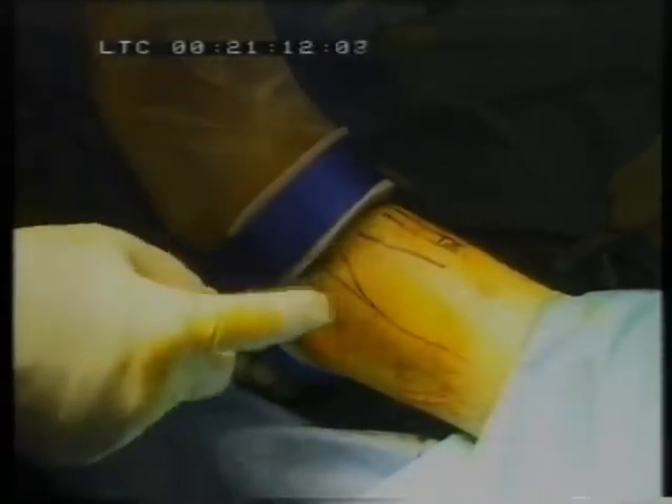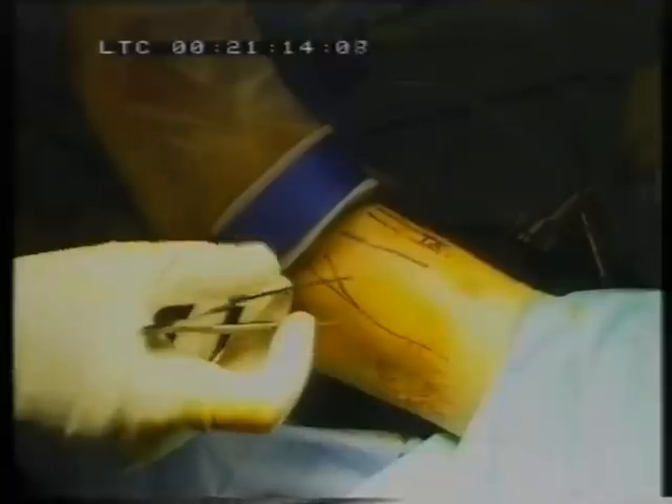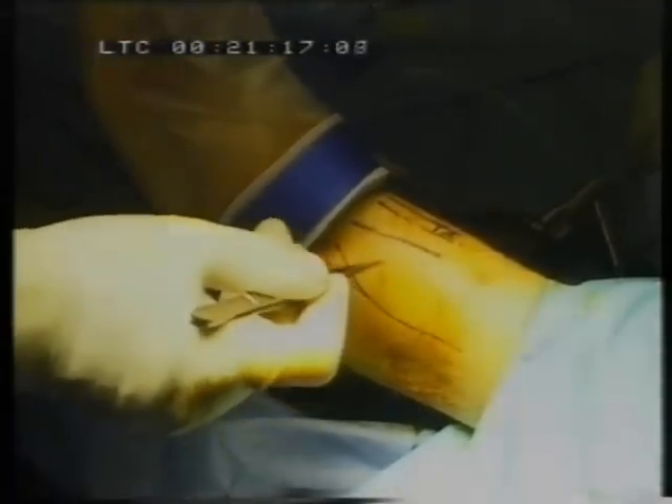This patient has chronic sprain syndrome which he's had for approximately four to six months after a work injury, and you can see that he has quite marked swelling in the lateral aspect of his ankle.